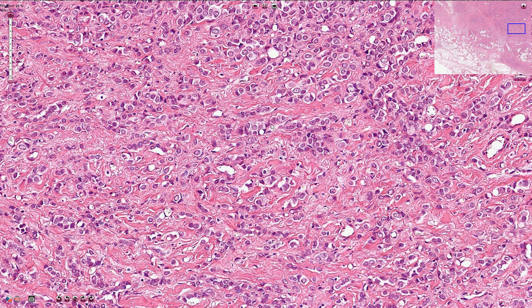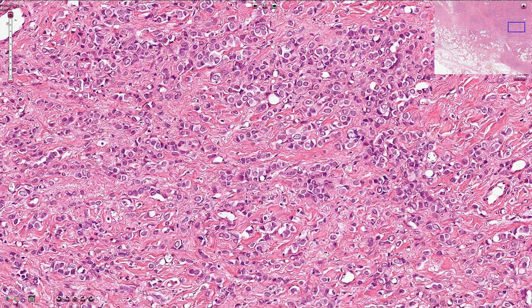The Indian file pattern is so named because these cells resemble Indians going hunting one after another in a line. We can also see single cells; however, tubular or ductal structures are not present. Solid nests are also not present because we lose cellular adhesion.